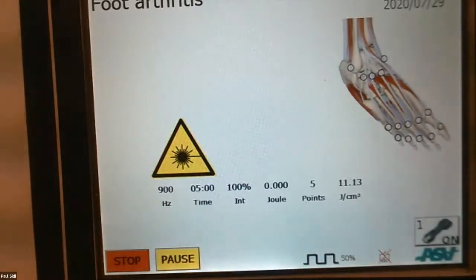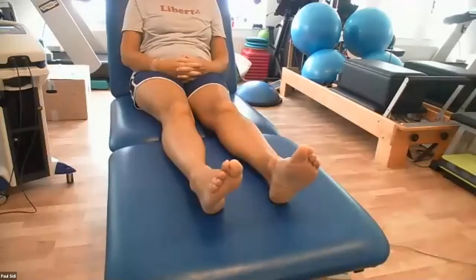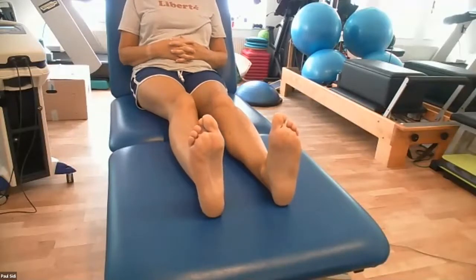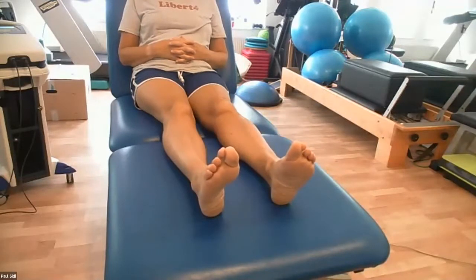When you're using this, make sure you're using the glasses. At the end, I want to quickly go through this leaflet which Celtic have handed out. If you have the laser, you have to read it, sign it, and send it back to them to make sure you're covered. We're going to put the glasses on, because infrared light, which this is using, you can't see. You'll see a red thing here, which is an LED just showing you where we're putting it, but you can't see infrared light. That will fly off anything that's metal. If it goes into your eyes and you're not wearing your glasses, you can cause retinal damage, even blindness. And that's one thing you don't want. So make sure you're wearing your glasses.